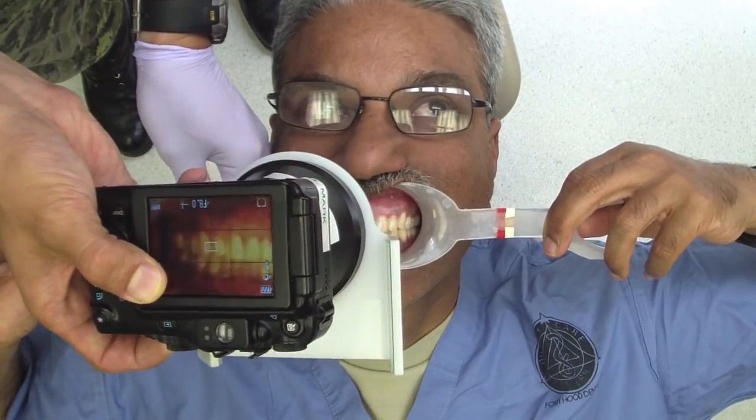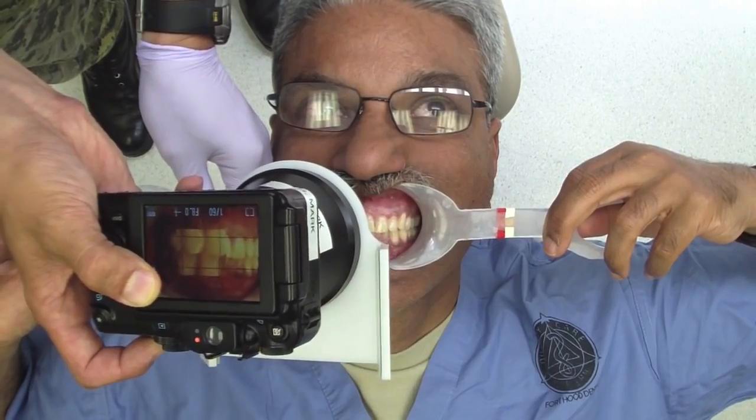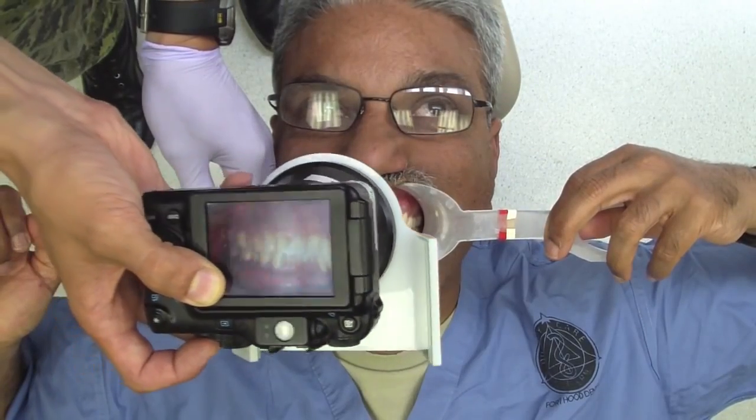Okay. So you can see how now what I'm looking for is a right buccal shot, and what our ortho mentor suggests is we're looking to go from our maxillary left canine, or our lateral incisor, and get that buccal corridor you can see there to the first molar at least.